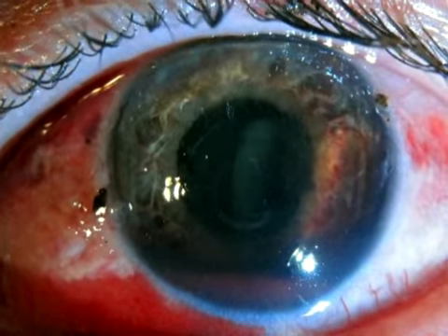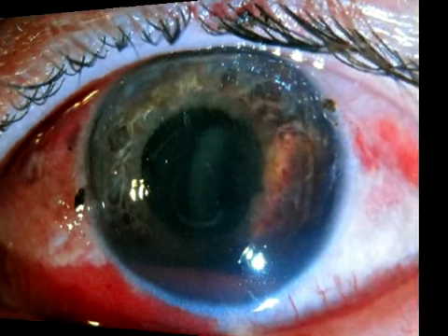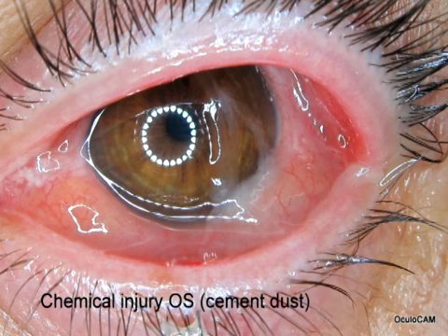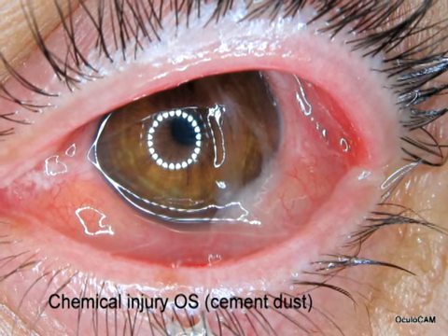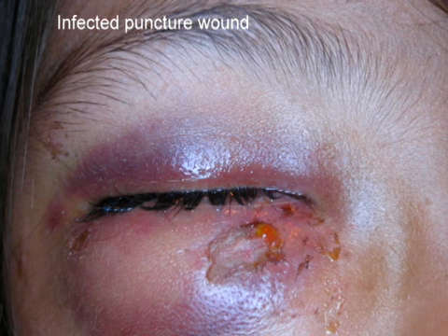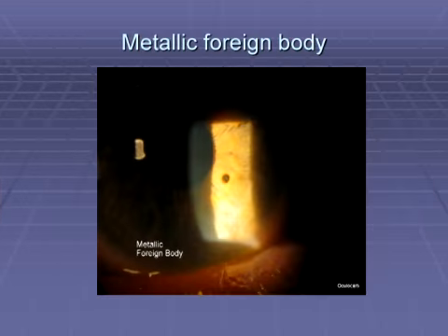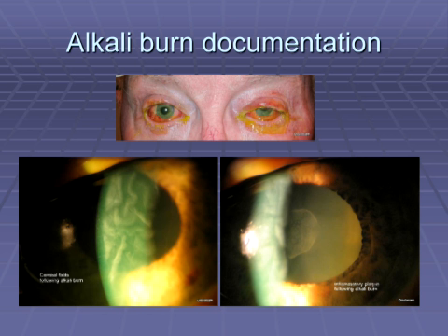In today's environment, clinicians must be wary of cases that may have a higher risk of litigation, and OculoCAM may be helpful to protect both the doctor and the patient. All cases of trauma, personal injury, and workers' compensation are suited to photo documentation. Foreign bodies such as this can be easily photographed before removal to document necessity. The final series was used as documentation of an alkali burn from anhydrous ammonia in a workman's compensation situation.